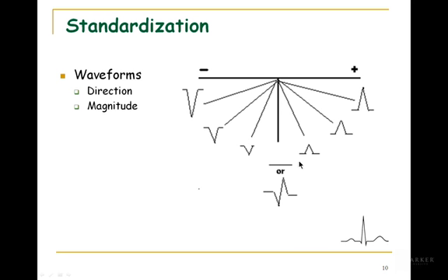We call it isoelectric or baseline. Or you might have what we call a biphasic or equiphasic recording, in that if I measured the voltage here and here and added them together, they'd add up to 0. So one of the things that determines the magnitude of the waveform would be how the current is flowing relative to that particular lead that you're recording. Whether or not it's upwards deflected or downwards deflected is determined by whether it's running towards the positive recording electrode or the negative recording electrode.